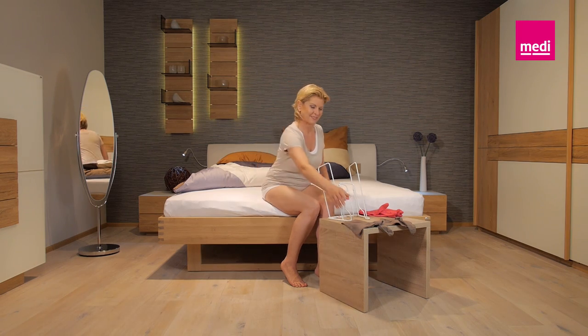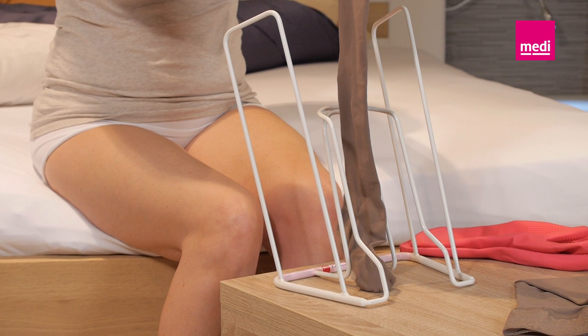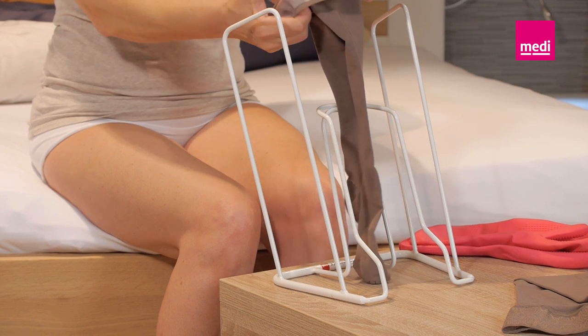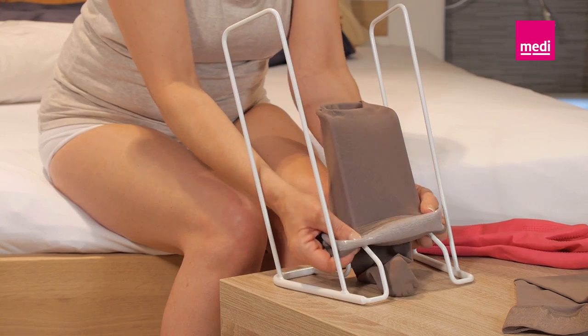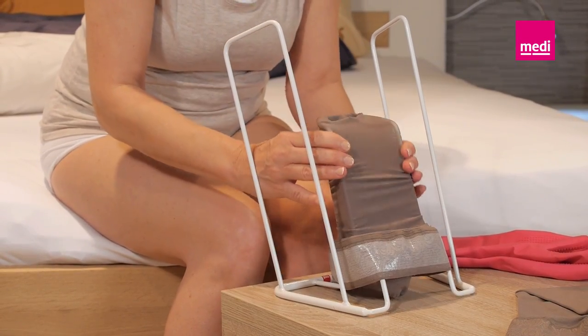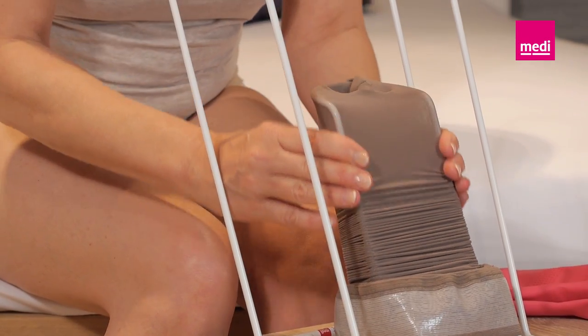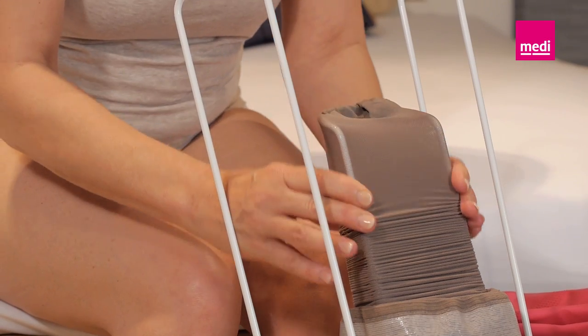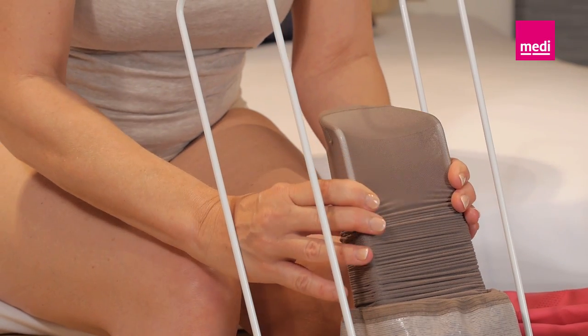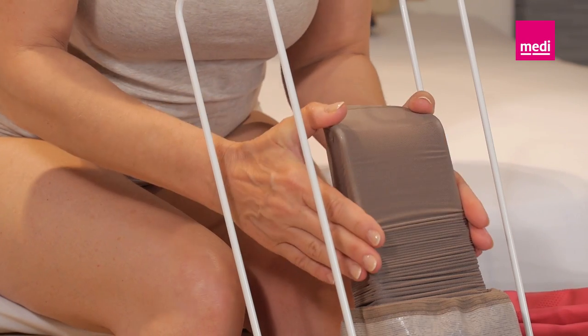To slip your compression stocking over the Medi-Butler, place the ladder on a firm surface with the wider side of the base facing you and the opening in the semi-circular frame facing forwards. Place the compression stocking in the stirrup with the toe of the stocking facing forwards and the heel facing towards you. Now, turn the top band of the stocking outwards over the frame. Carefully slide the stocking down over the stirrup until the heel appears over the edge of the frame.